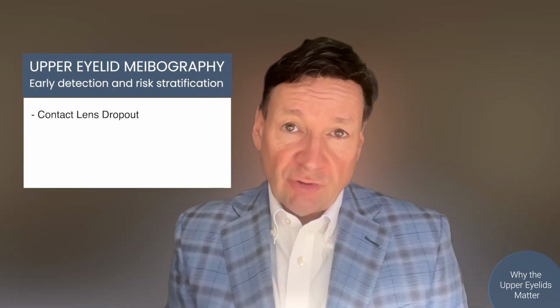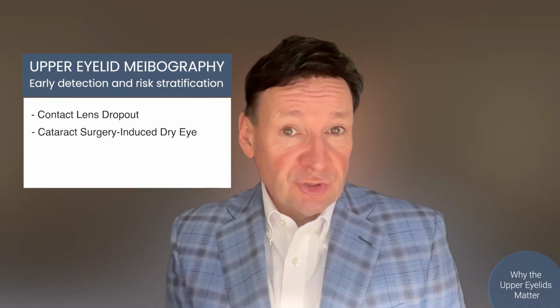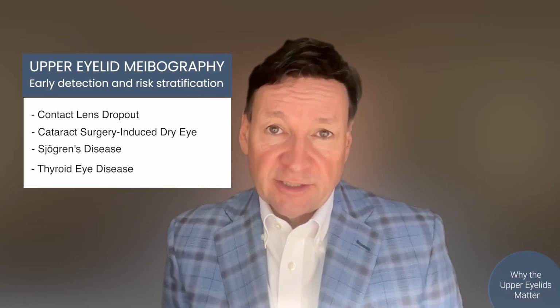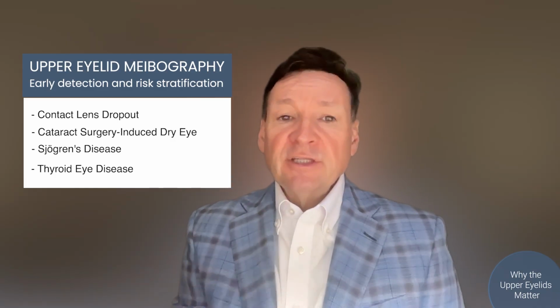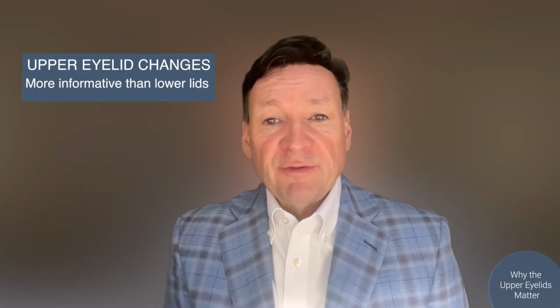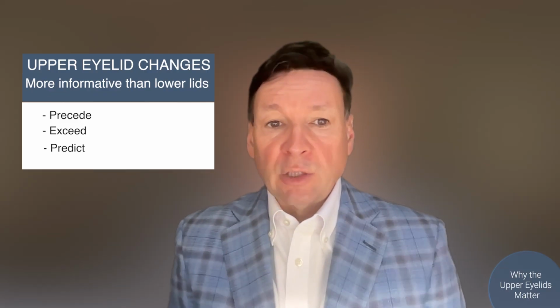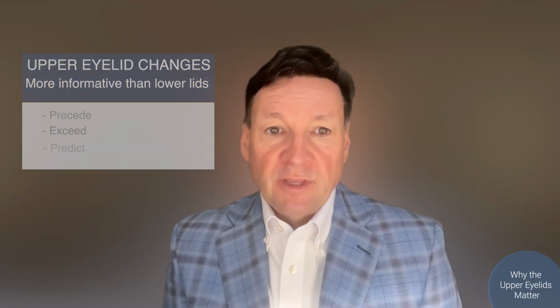be preserved. Upper eyelid meibography is particularly valuable for early detection and risk stratification in four major areas: contact lens dropout, cataract surgery-induced dry eye disease, Sjogren's disease, and thyroid eye disease. In each of these conditions, upper eyelid changes often precede, exceed, or better predict clinical problems than lower lid findings alone.